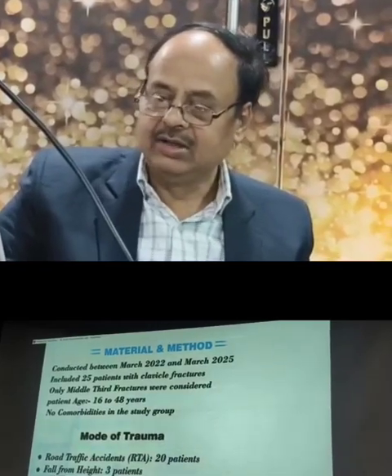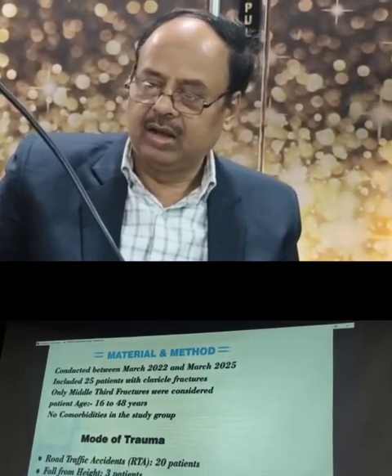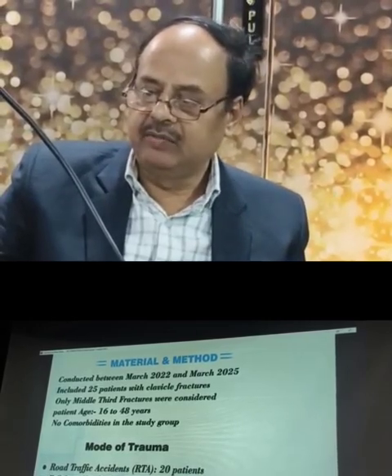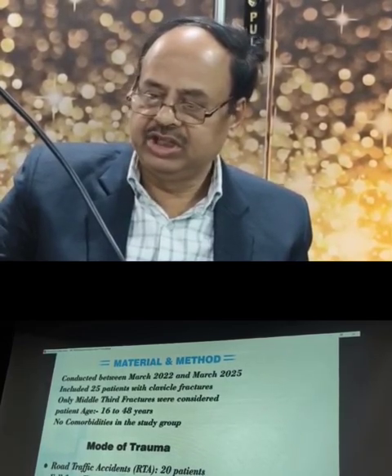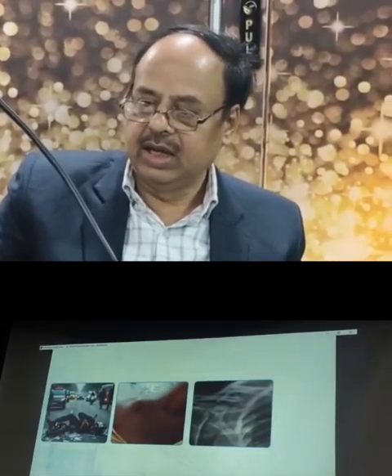The age of the patients was 16 to 48 years and no comorbidity was found in our study group. All patients were treated with titanium elastic nails. Road traffic accident was the main mode of trauma, whereas fall from height and fall on the outstretched hand were the other modes of trauma.